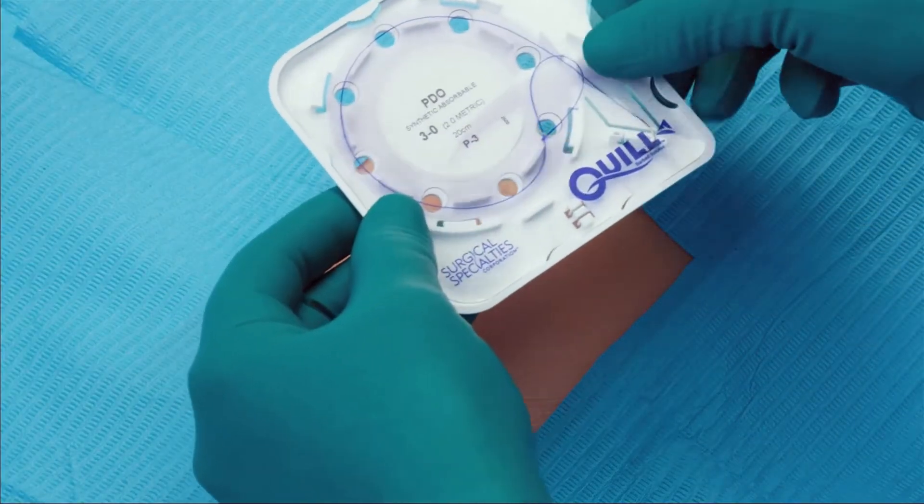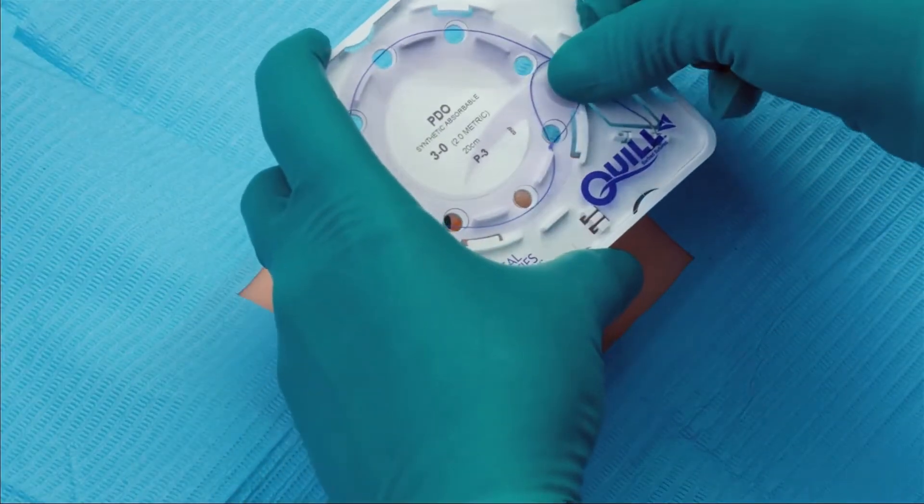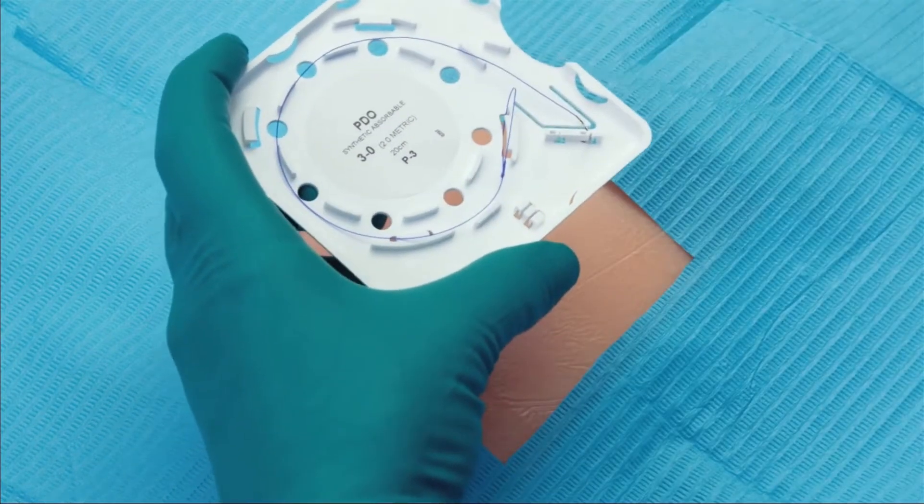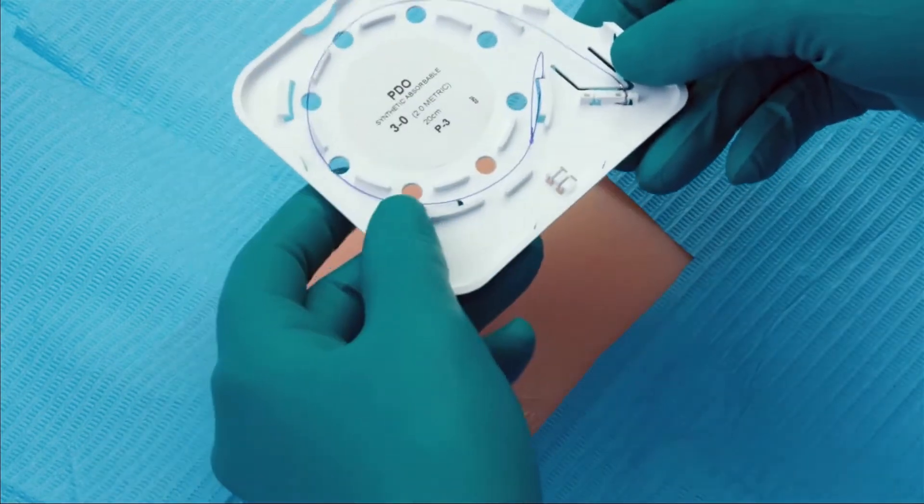I will be demonstrating how to use quill suture. We will now demonstrate a two-layer closure using a single strand of the quill unidirectional barbed suture.